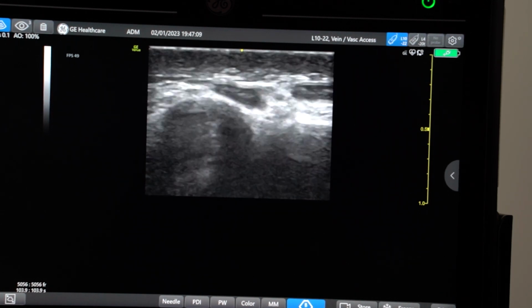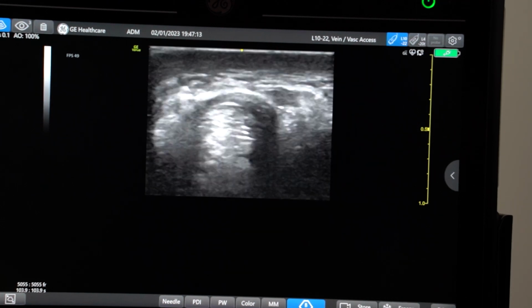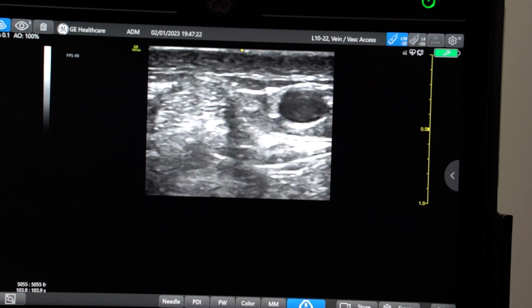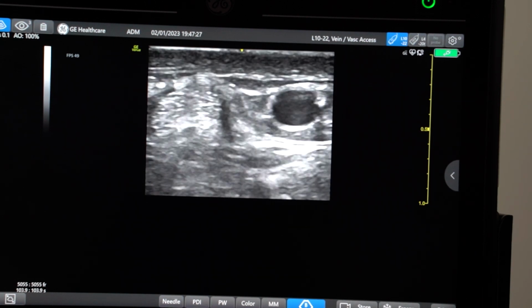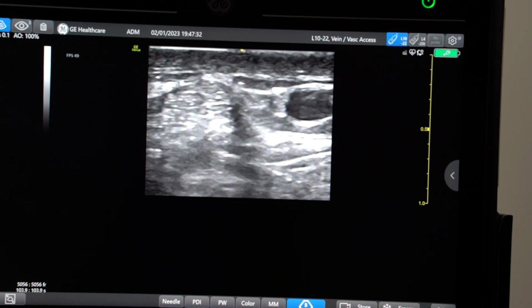That hard white layer that you can sort of hopefully see a little bit of is actually the bone popping through a little bit deeper, where it gets very bright white just there on the right of your screen, and that's bone. So you can see the sort of interface of tissues and planes. It's very, very useful in clinic and dynamically. So that quick demonstration of ultrasound has hopefully shown you the value it can bring into a clinical consultation, but also for treatment and targeted precise treatment. It's routine for us to use that for all treatments, injectable treatments in particular.